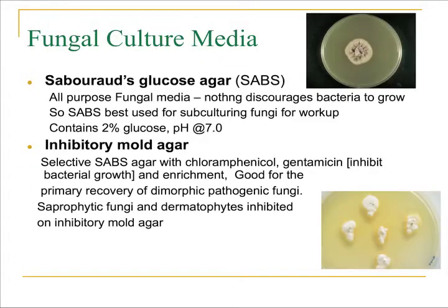On the next slide, we start talking about the fungal culture media. The media that we use in the mycology laboratory is different than that used in bacteriology. Two of the most common media that you hear about in the mycology laboratory is the Sabouraud's glucose agar, known as SABs, and inhibitory mold agar. Sabouraud's agar is really an all-purpose fungal media.